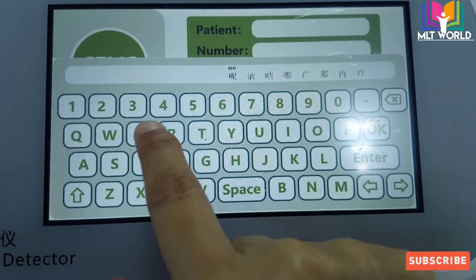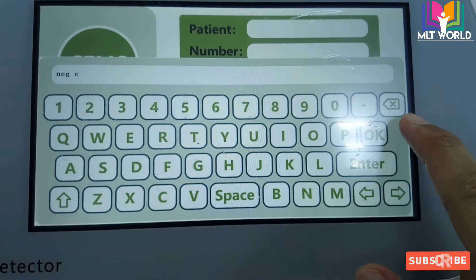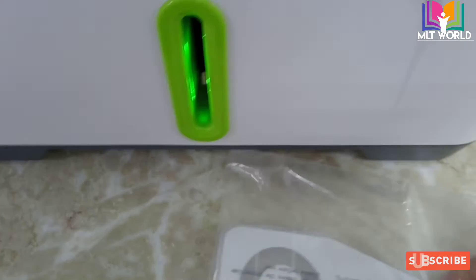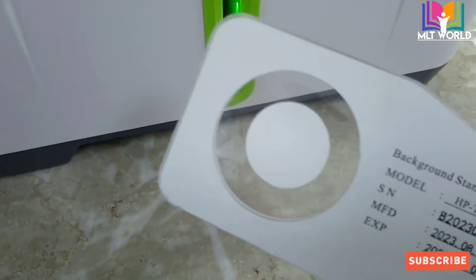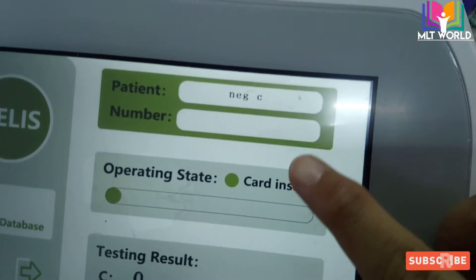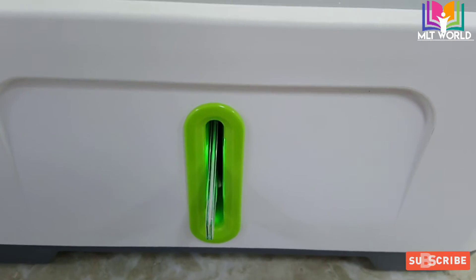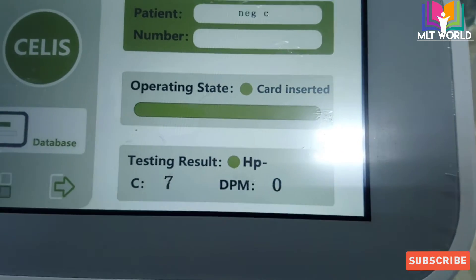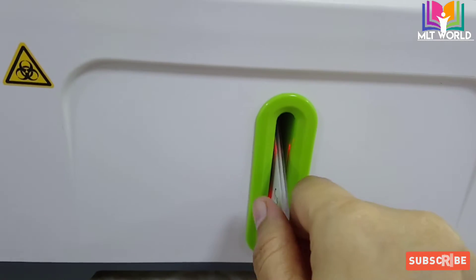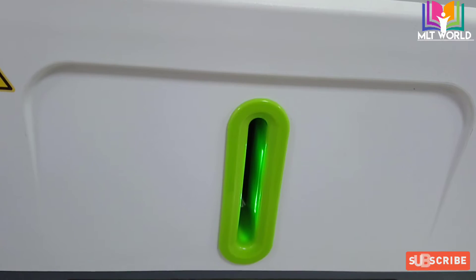First we will run the negative control and positive control. We program the controls the same way as a patient — there is no specific column for controls. In the patient option I write 'NGC' meaning negative control, then enter and okay. The negative and positive controls have a very long expiry so daily use will not cost much. Now the card is inserted and the green light is blinking, which means the test is running. The negative control result came as zero DPM — HP negative. When the test finishes it will show a red light; we wait for the green light before processing the next sample.